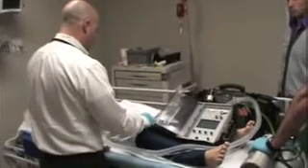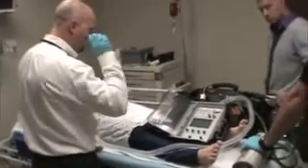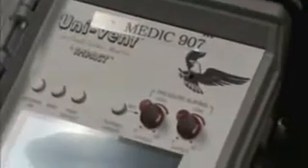Next thing, pressure alarms. The ventilator has a high and a low pressure alarm. We would set a low pressure alarm threshold to let us know if we're not delivering enough pressure or if we've disconnected the circuit by accident and we didn't know it. So let's say the ventilator pops off and I've set my pressure alarm to, we'll say, 5 or 10. When it doesn't receive that pressure coming back, it'll give a couple of breaths and it's going to give me an alarm to check the circuit. It suspects there was a disconnect.